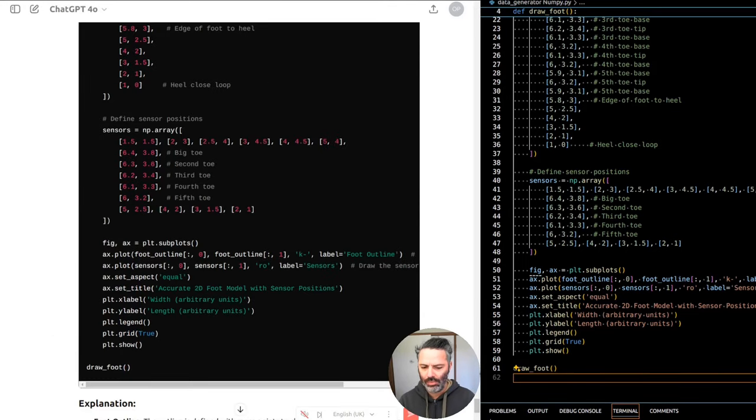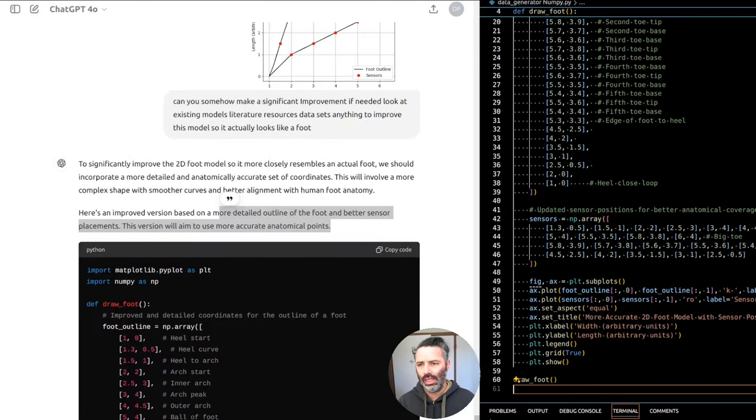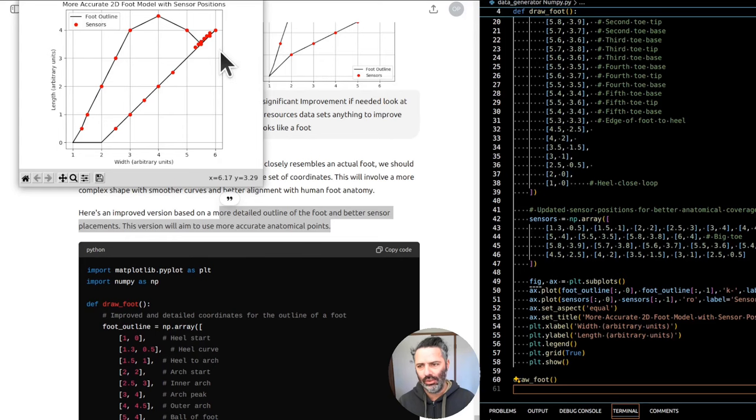Can you somehow make a significant improvement if needed? Look at the existing models, literature, resources, data sets, anything to improve this model so it actually looks like a foot. This is what we had. I don't know if it's adding all these toes or something. I don't know what it's doing.